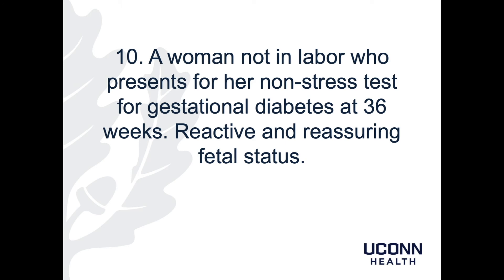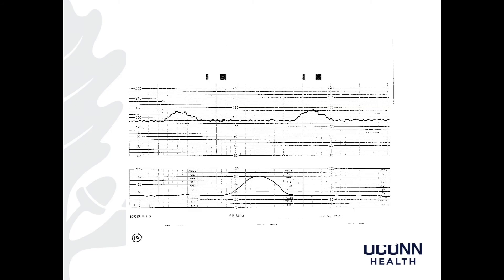Patient 10 is a woman not in labor who presents for her non-stress test for gestational diabetes at 36 weeks. Her non-stress test is reactive, which is reassuring for fetal status. My read: baseline of 140s, moderate variability, positive accelerations, negative decelerations. This is Category 1, and it is also reactive.